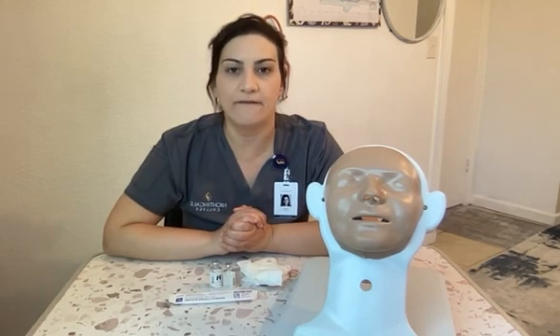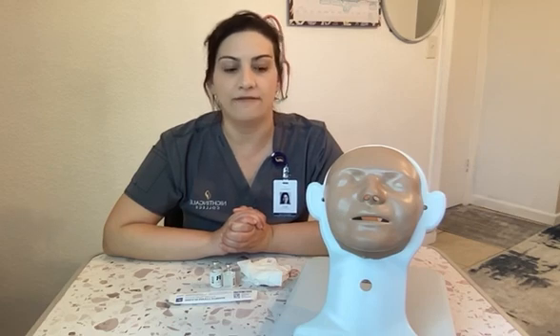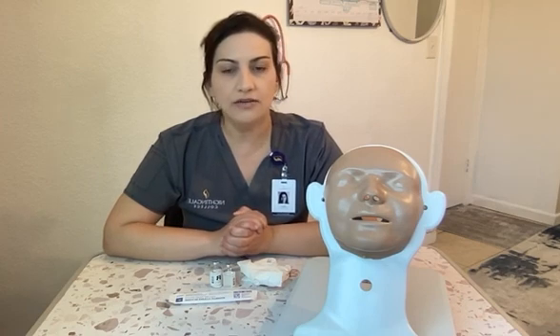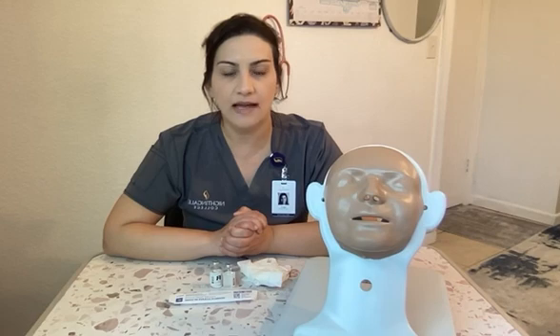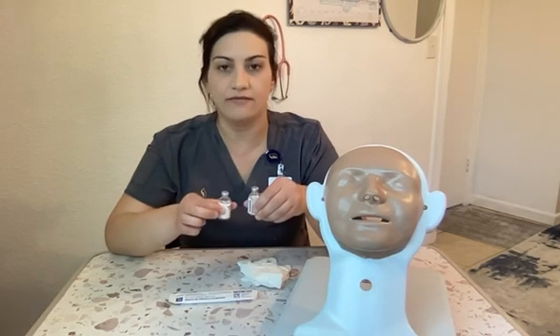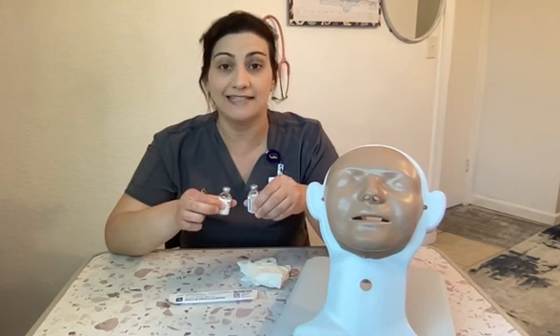Can you please verify your first name, last name, date of birth? As she verifies that, I will verify her wristband. This is going to be my 2 patient identification. Do you have any allergies for me? Any seasonal medication allergies that we need to be aware of, Mrs. Smith? No allergies? Okay, awesome. So as I laid my eyes on my patient, I'm going to verify for the 2nd time against the MAR.